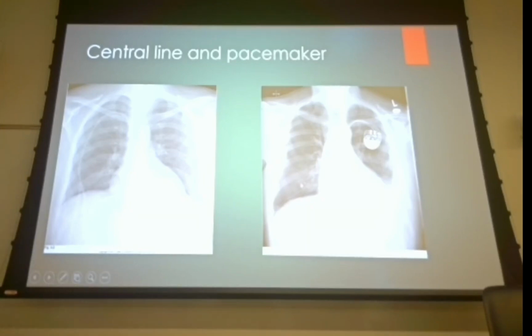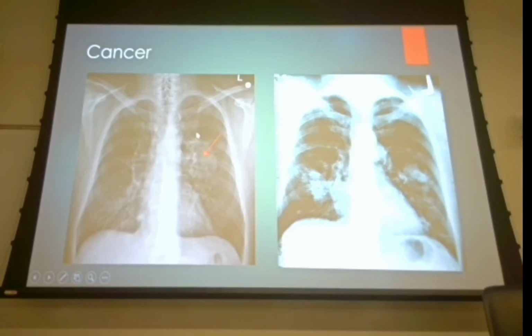You know, pacemaker. You have internal, external pacemakers. If a patient has an external pacemaker, make sure you don't pull a pacemaker lead. I saw that happen one time. I didn't see it actually happen, but I was working in a hospital where a technologist accidentally pulled a temporary pacemaker lead in positioning for a chest X-ray. The patient died, you know, so know your environment.